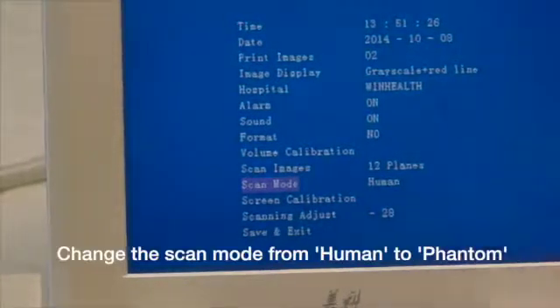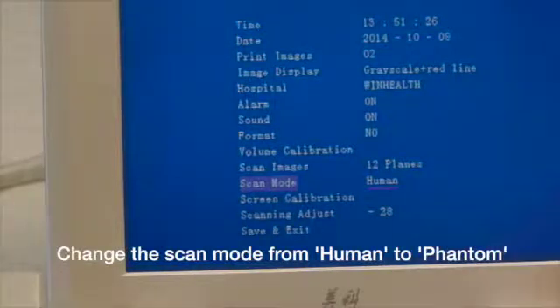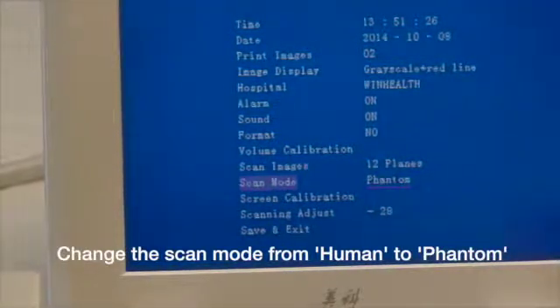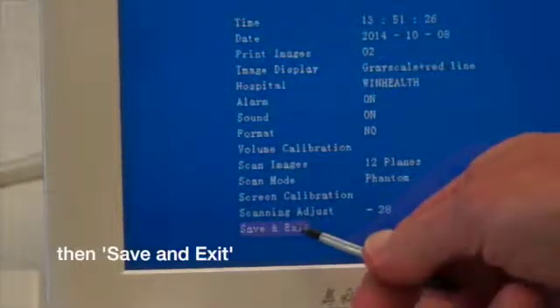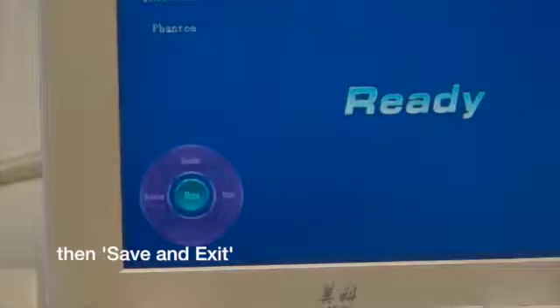You enter the menu screen, select the Scan Mode, then select Human and change it to Phantom by means of the keyboard. Then go down to Save and Exit, and that sets the machine up ready for calibration.